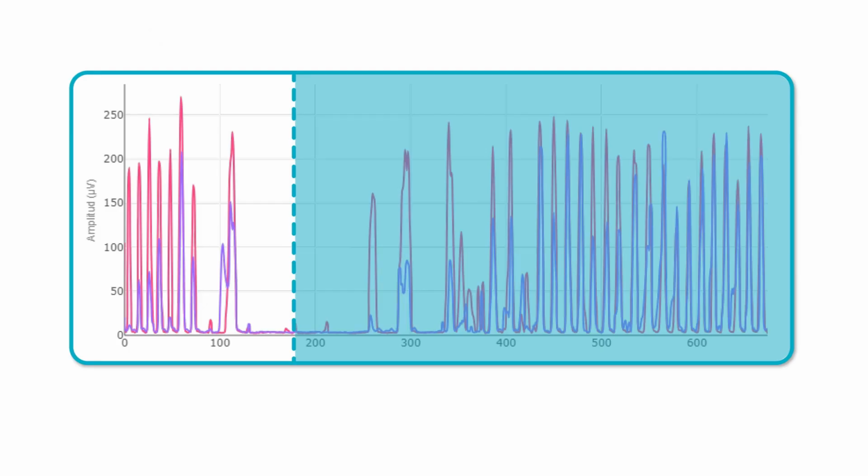To address this altered pattern, we use a key tool, biofeedback through electromyography, which allows the patient to visualize their activation in real time and adjust their performance. Let's look at an example of reeducation with biofeedback using two different strategies. The first is to use biofeedback with a simple instruction. The patient is asked to simply raise the purple line corresponding to the right anterior tibialis on the graph. Take a look at the results. In this case, we were not able to increase muscle activation using only biofeedback and a verbal command. It was not enough to modify the motor pattern.